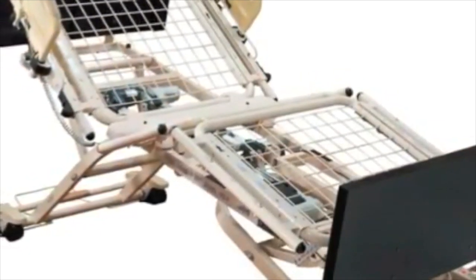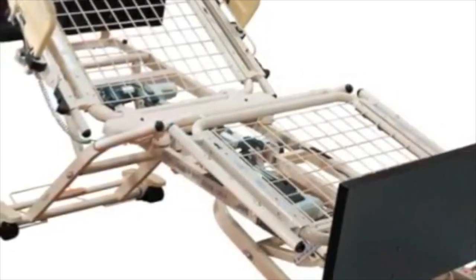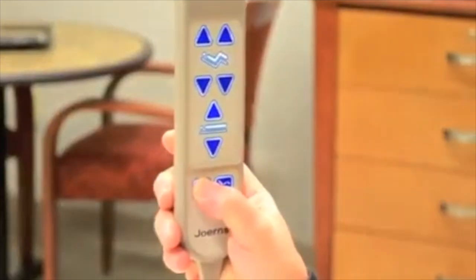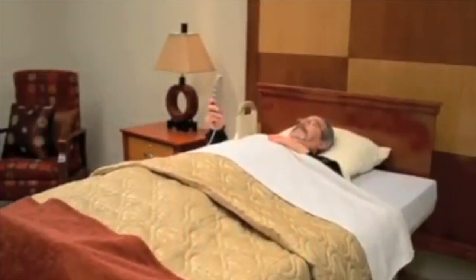Comfort chair is also an ideal position for residents who suffer with pain in their lower legs. To put the bed in comfort chair, hold the button on the lower left side of the pendant. This will automatically place the bed into a chair-like position.